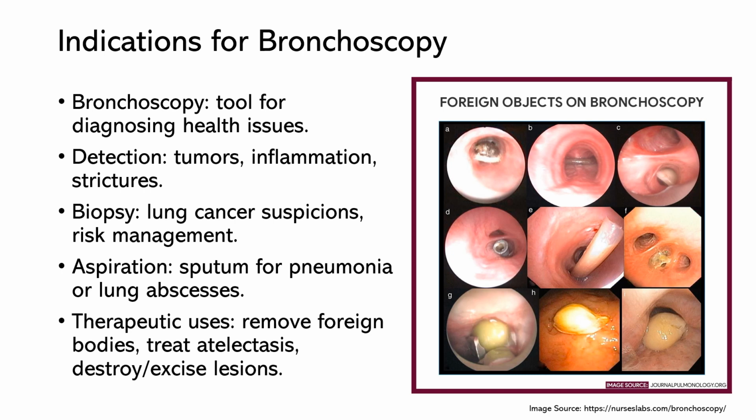If you suspect lung cancer during a bronchoscopy, you can also obtain a biopsy of suspicious tissue. Okay, now yes, that will add risks of bleeding or perforation, but we can manage those with the right nursing interventions. What about our patients who have pneumonia or lung abscesses? A bronchoscopy can aspirate deep sputum for culture and sensitivity testing or cytology.